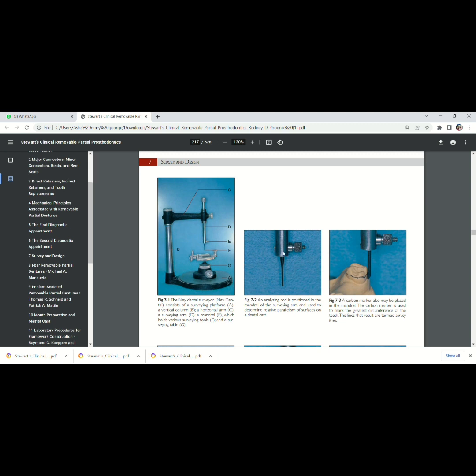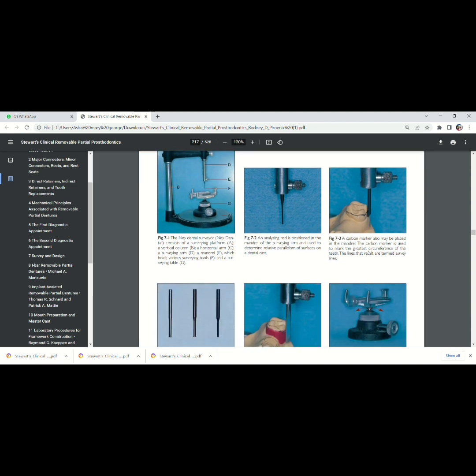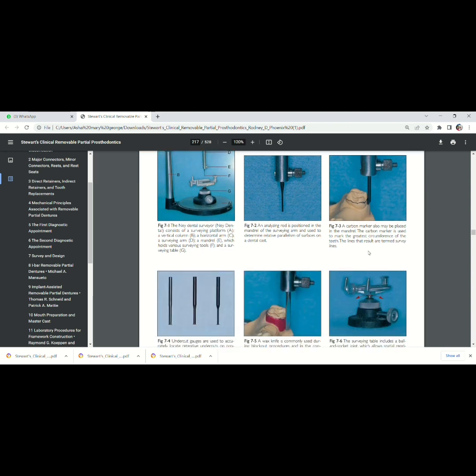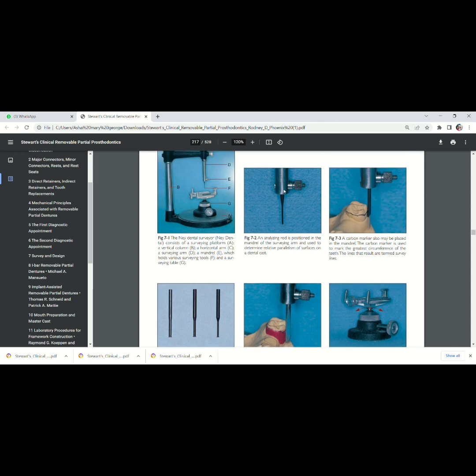Here you can see the analyzing rod is attached. Here you can see the carbon marker is being attached. Here wax knife is attached. You can even place undercut gauges also. So various surveying tools are attached on the surveying arm.